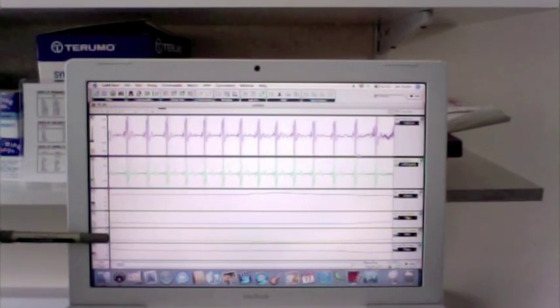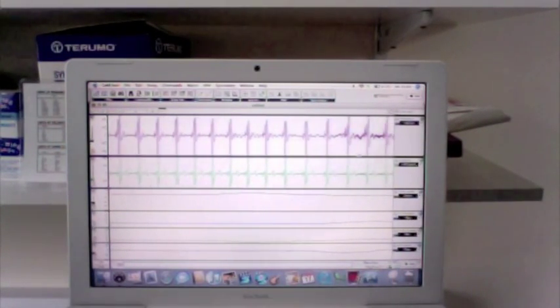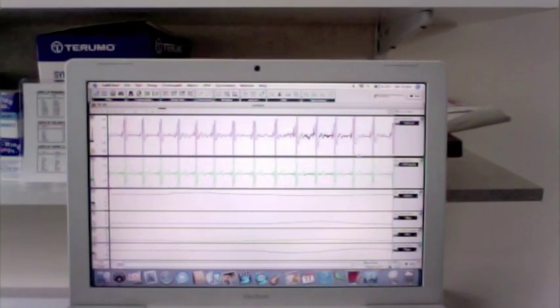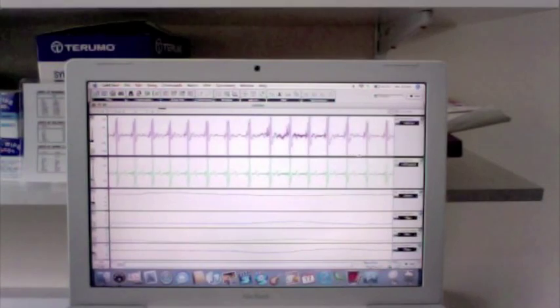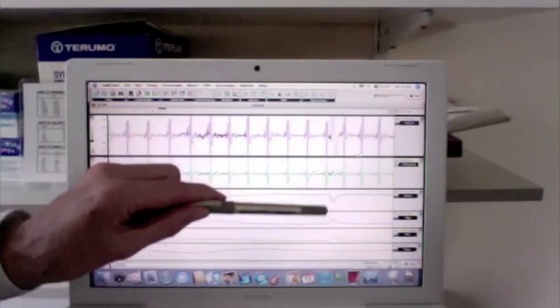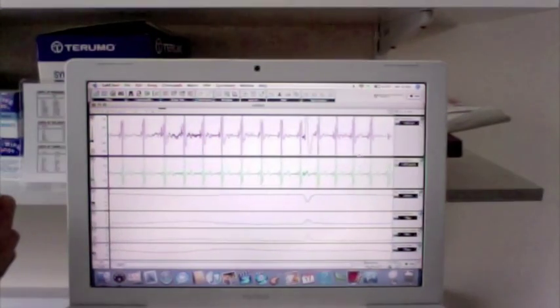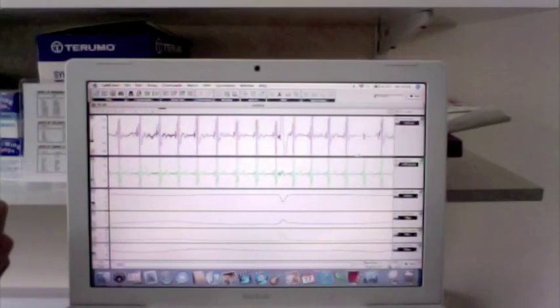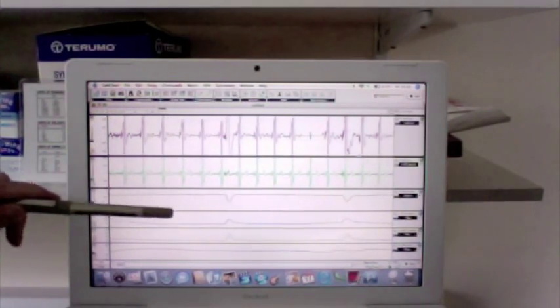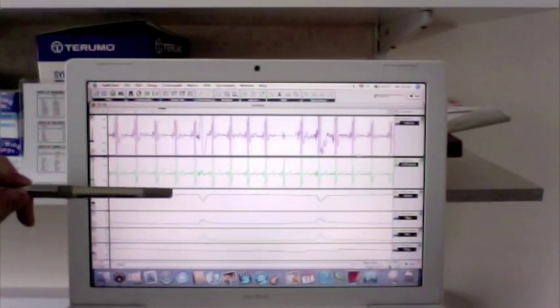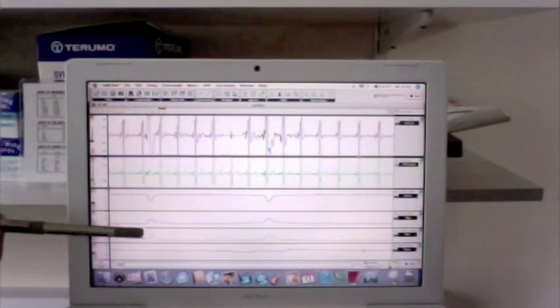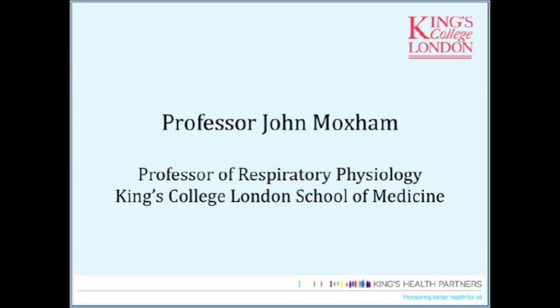If we just have a small sniff, you can see the sniff pressures — the esophageal, the gastric, and the transdiaphragmatic pressure.